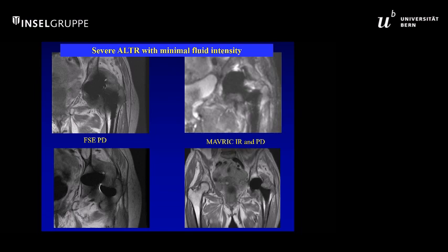Of interest, in that last cohort, about 25% of the patients were revised based on MR alone. They were asymptomatic, but had adverse tissue reactions that were confirmed by histology. So these can be severe, often with very little fluid around them. You can see this very thick, aggressive synovium that extends into the abductors and causes adjacent tissue corrosion.